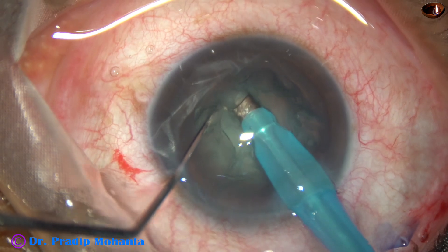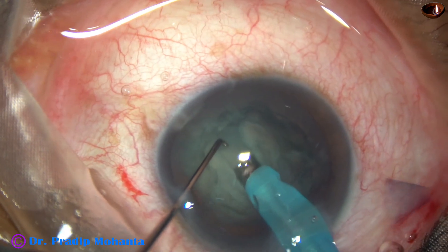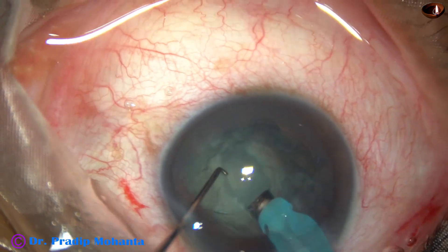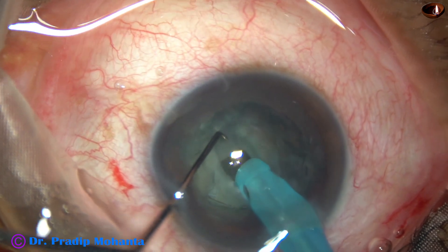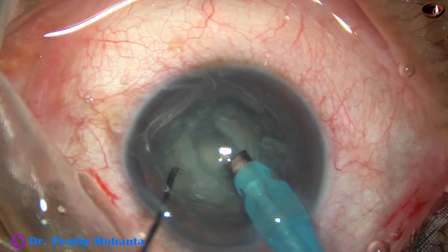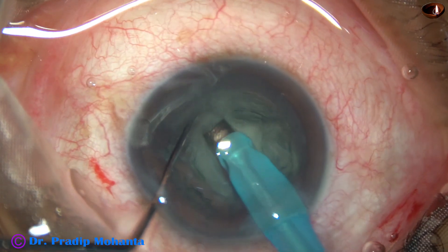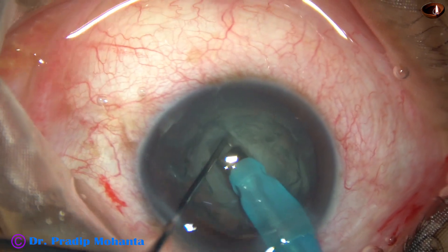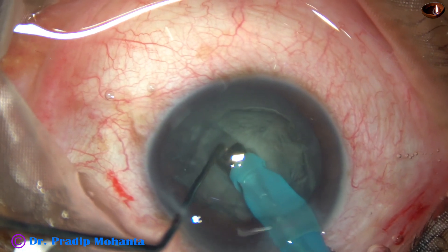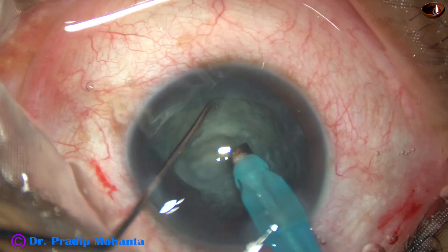Flow rate is 20 and ultrasonic energy used in this case is 50%. If the cataract is hard we can use higher power. The tunnel has been widened a bit, rotated 180 degrees, and a bit of sculpting is done on the other side. Now I go to the floor of the groove and applying opposite forces.